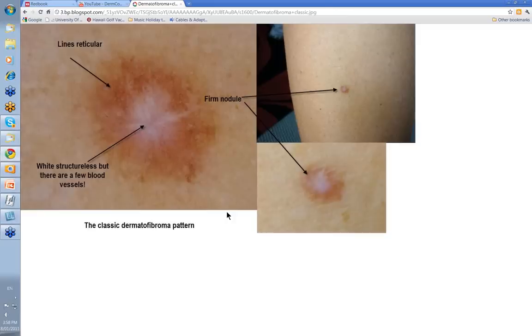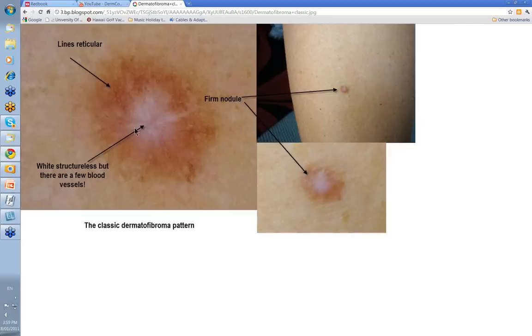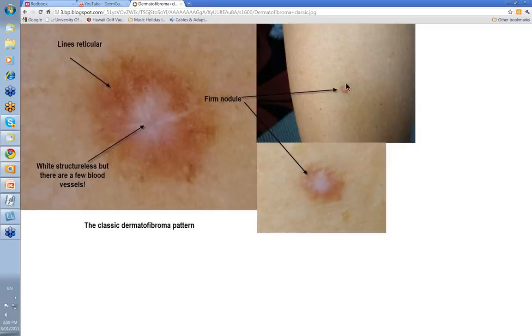This is the classic dermatofibroma pattern. Here you can see the white central structureless area, and surrounding it you have this network or lines reticular — very obvious here. The white structureless area occasionally has a few blood vessels in it. Often it has very angulated areas here, signifying the scarring nature of the process, or at least the laying down of collagen. This is the lesion clinically, and this is the classic pattern: white structureless centrally with lines reticular round about.